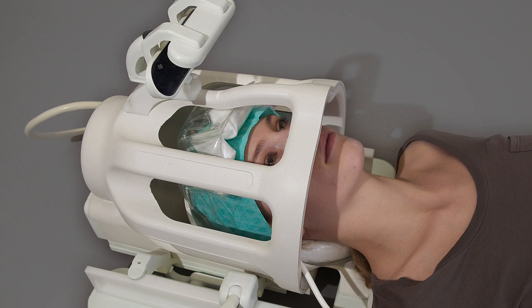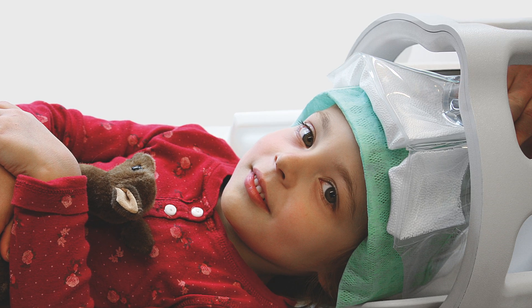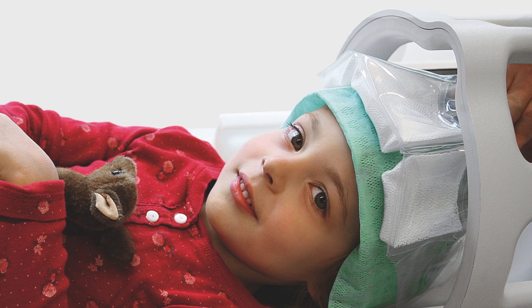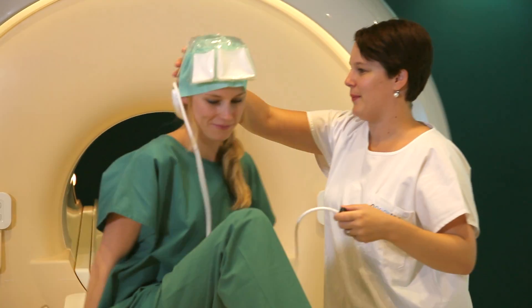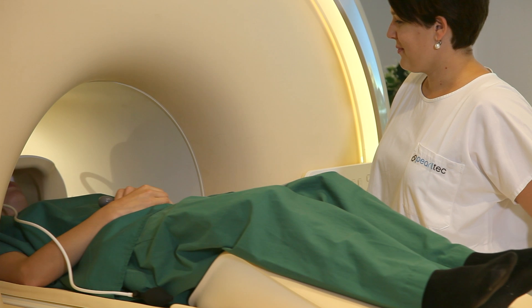The crania comes in two sizes, adult and child, and can be used in a wide range of MR head exams. It works especially well for patients who are difficult to fixate and in functional MRI assessments.